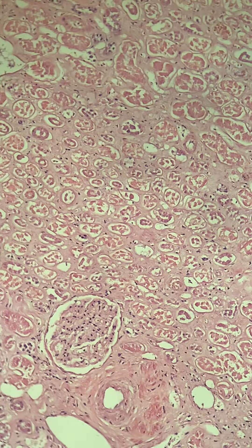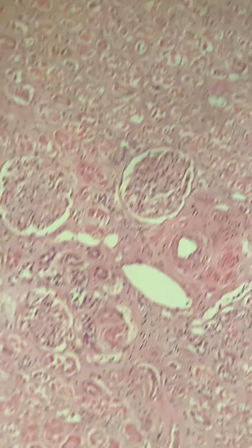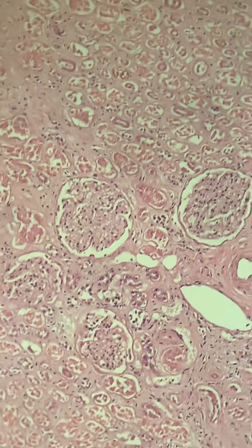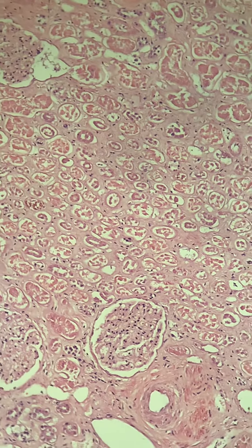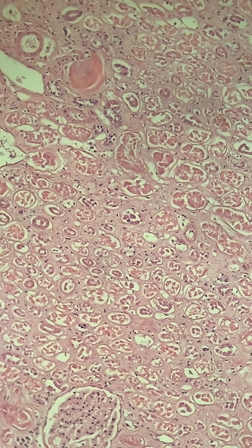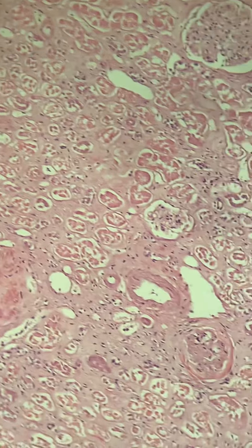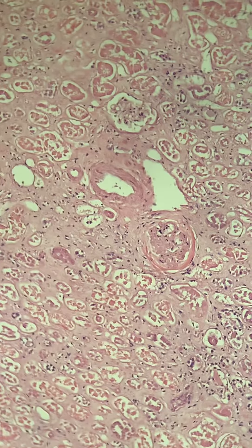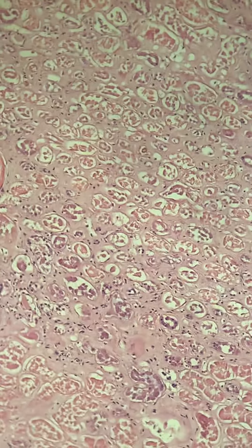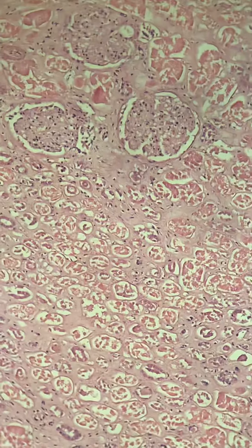I want to show you a relatively normal kidney. That's a relatively normal glomerulus — there are three or four of them in the field. You can see the tubules are necrotic, so acute tubular necrosis from sepsis and septic shock. But otherwise the kidney doesn't look that bad. This is an 80 plus year old man and there are some glomerular changes — 80 plus years old would probably have some vascular disease and hypertensive changes here.